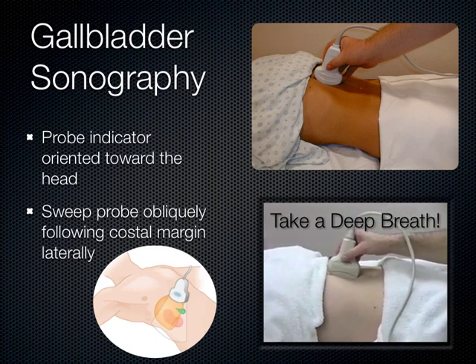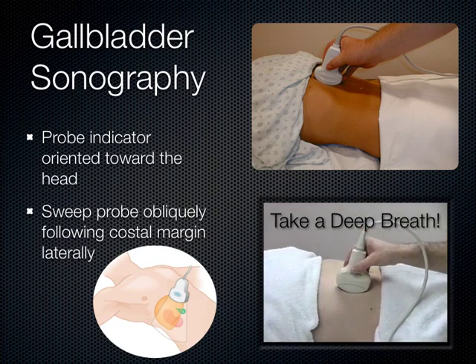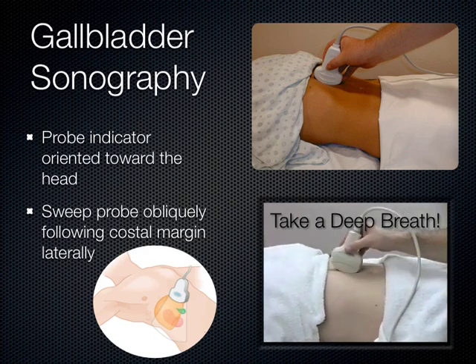Gracie, if you want to hand those out while I'm doing the gallbladder.